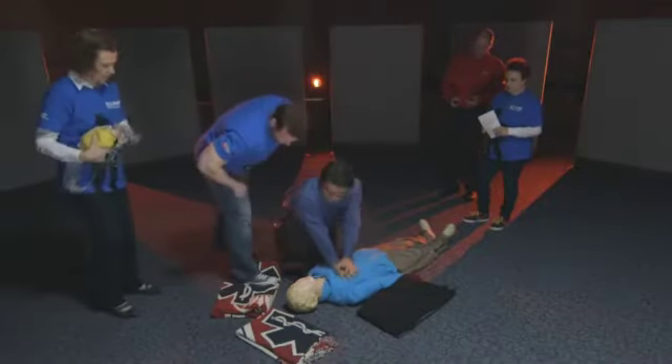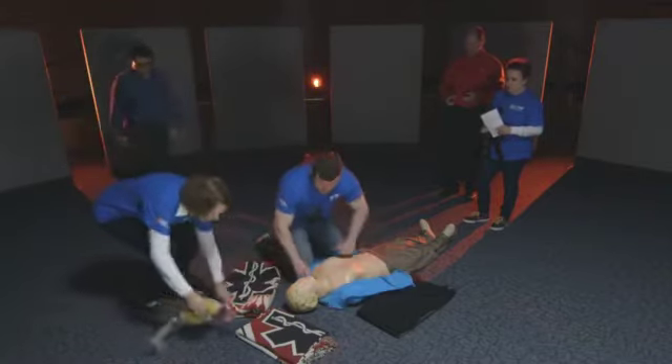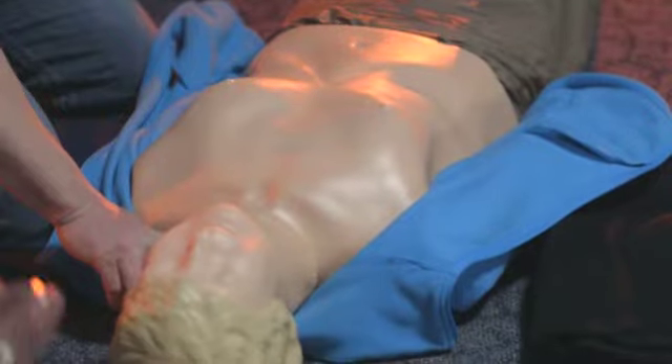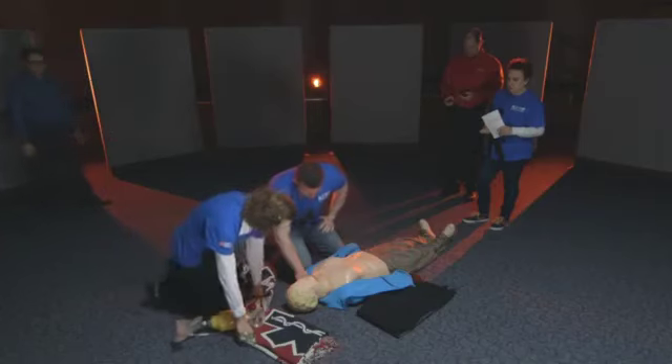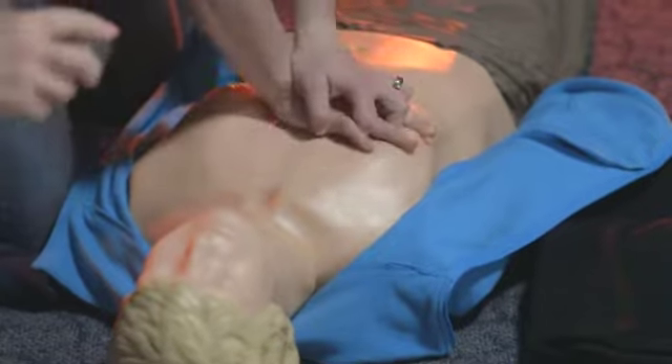Good job, sir. Let me go ahead and take over for you. Thank goodness you're here. Checking for pulse. Looking for breathing. No pulse, no breathing. Resuming compressions.